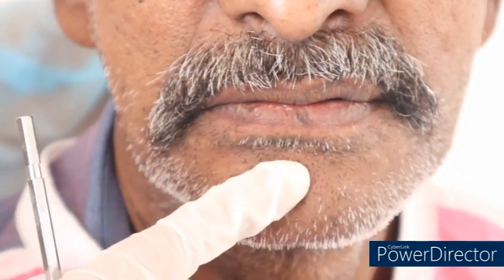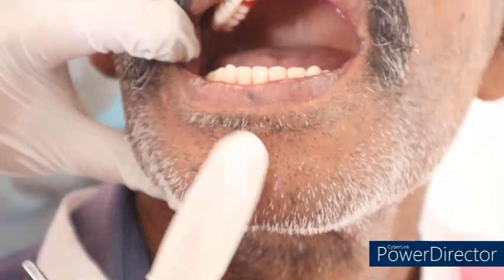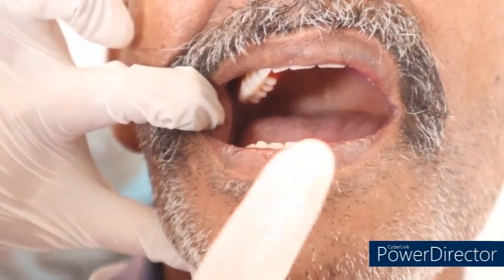So the second thing we have to check in the wax trial is the centric relation. In centric relation, what has to be checked is the constant contact of the posterior teeth. The patient should be asked, in the posterior most position, to swallow the saliva and bite. Now we have to check the contact of the posterior teeth. Now I am asking the patient to swallow the saliva and bite the tooth.